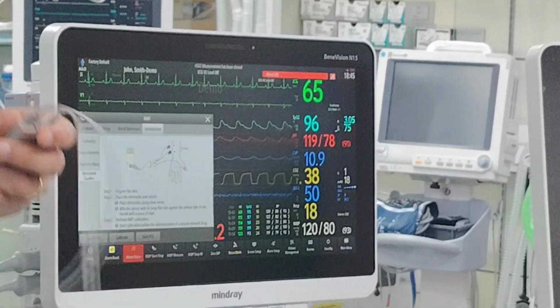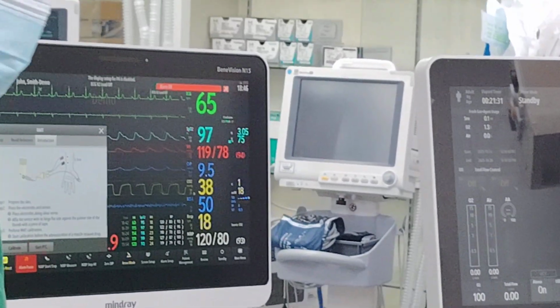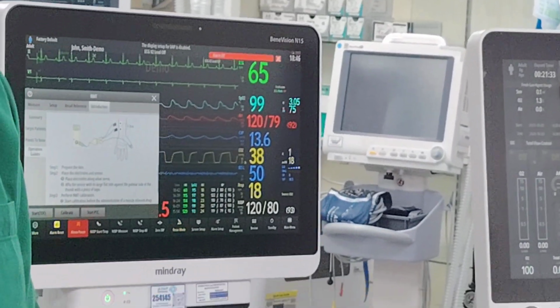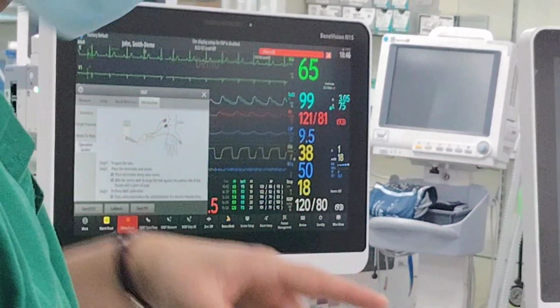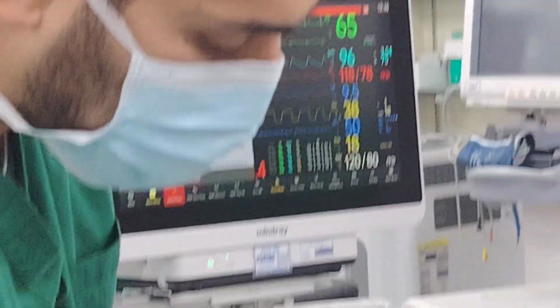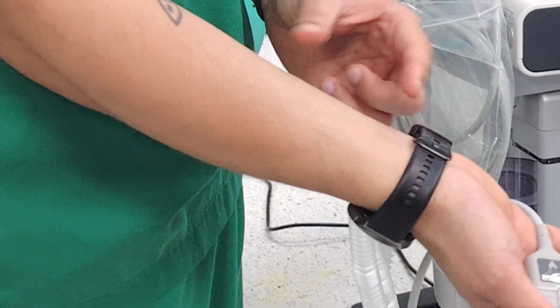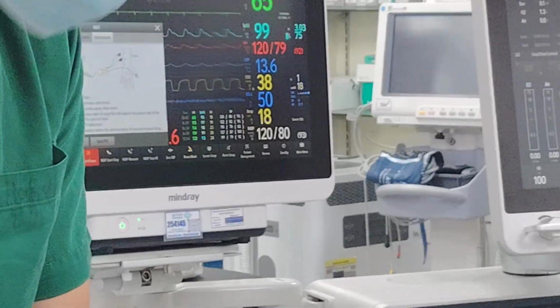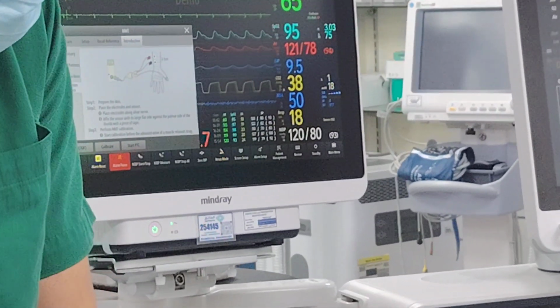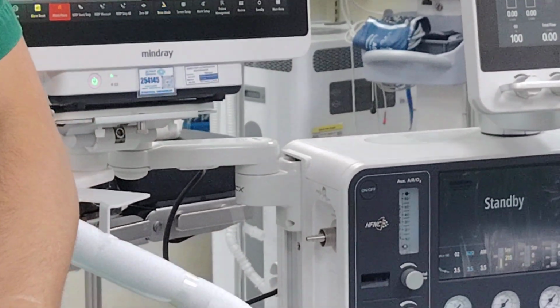So you have two electrodes. One of the common questions is, how do I know if the red is distal or proximal? Is it written here? Bravo, yes, very good. It's written here, and not only that, look. Any ECG electrode, you put them here. Maybe you don't know the exact location, it's also shown to you. It is towards the ulnar side, inside, with a few centimeters. Sometimes people put it on the bone section, and it can read not so accurately. It should be on the ulnar side.